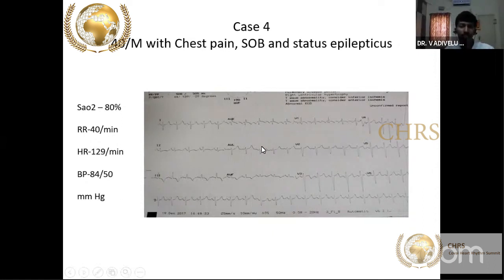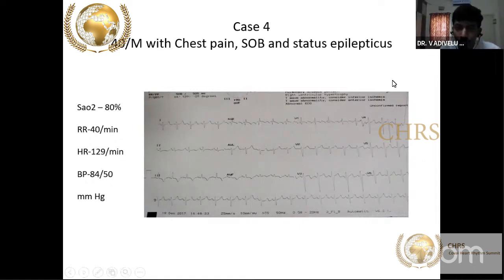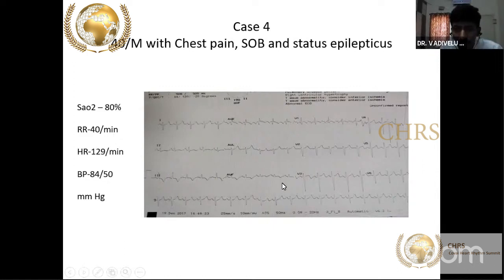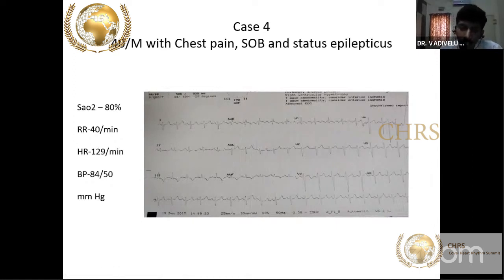The classical S1Q3T3 pattern: S wave in lead I, Q wave and T wave inversion in lead III, along with sinus tachycardia and right heart strain. In V1, R by S ratio greater than one, with ST segment depression and T wave inversion, indicates right ventricular strain. From this pattern alone, diagnose acute massive PE. This patient arrested before CT pulmonary angiogram could be done.